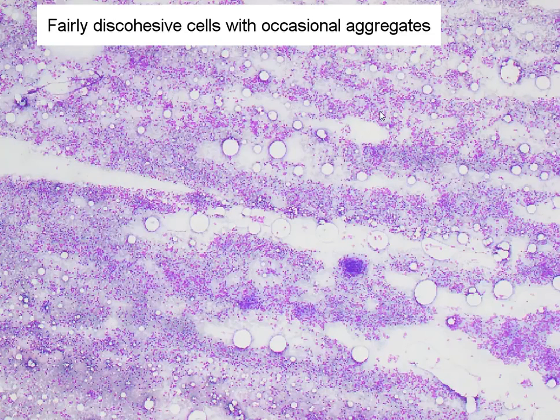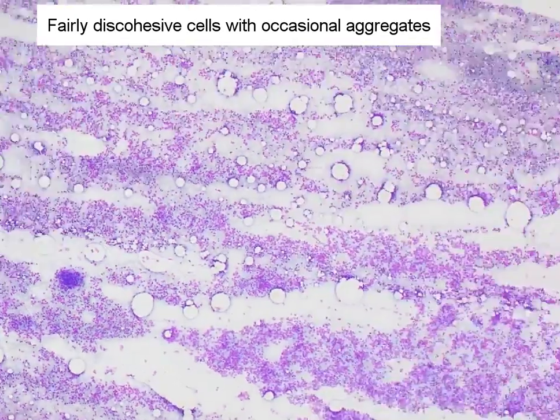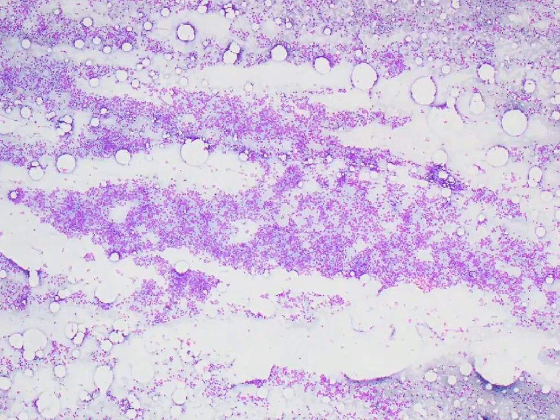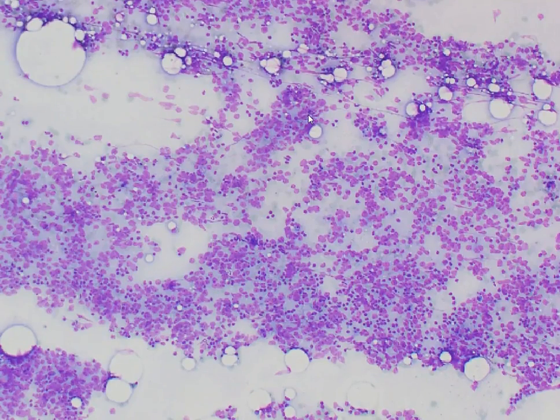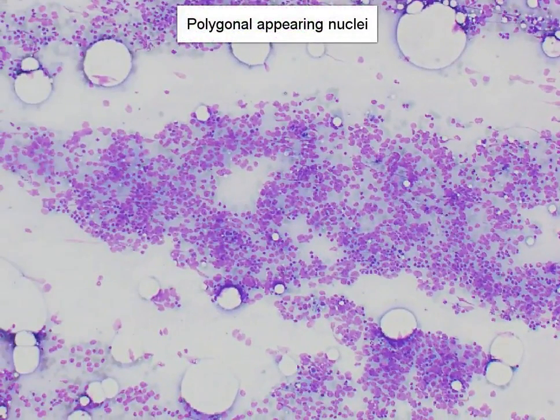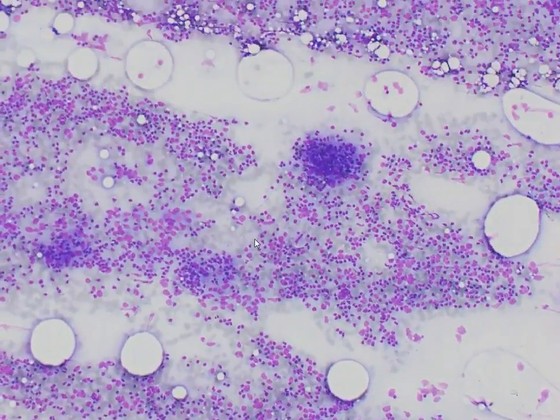At low power, we can see that this is a highly, highly cellular smear. Many of the cells actually appear fairly dispersed, although there is a suggestion of some tighter tissue fragments here. Moving around, we can again see this fairly dispersed look with several areas that appear to be a little bit more aggregated. Many of the cells have this polygonal nuclear shape, and we appreciate that they are bigger than resting lymphocytes.